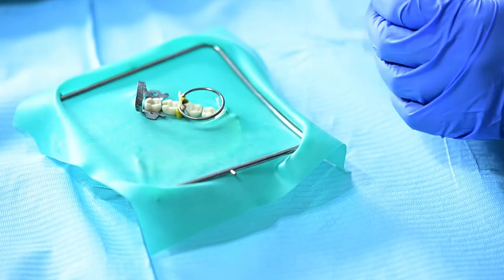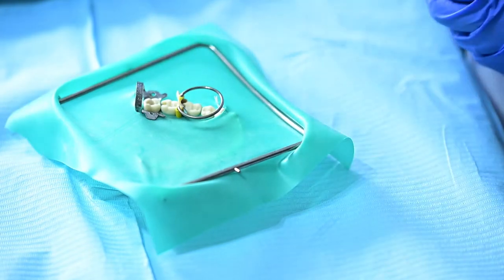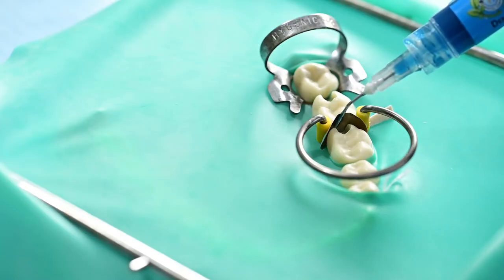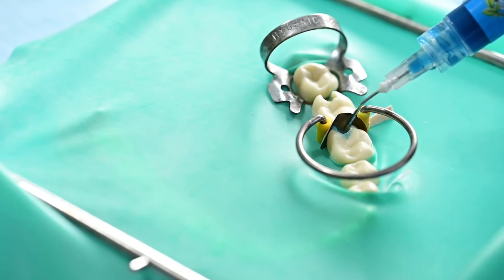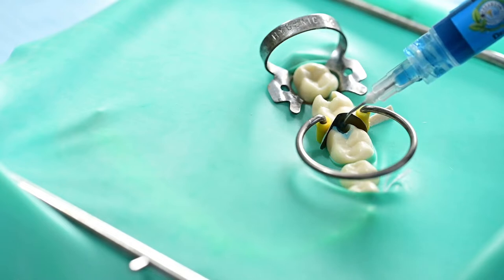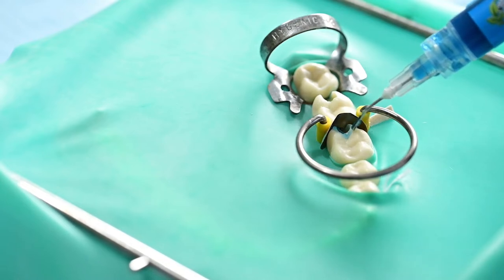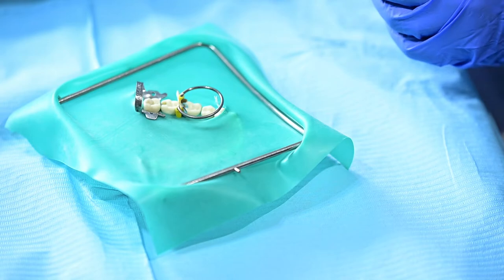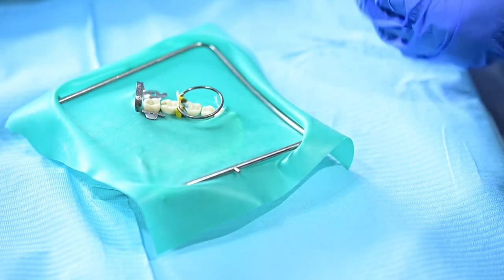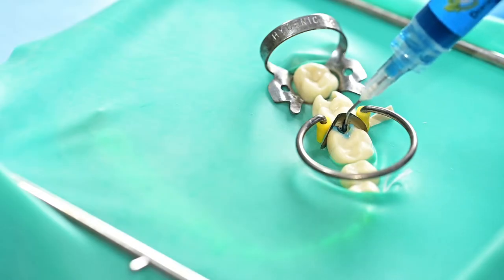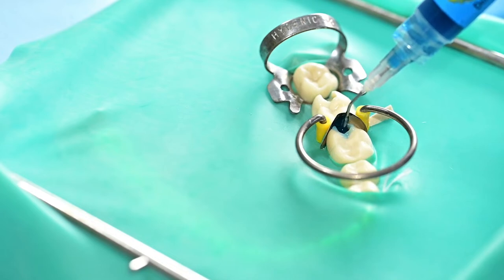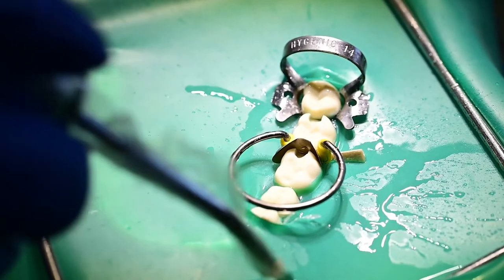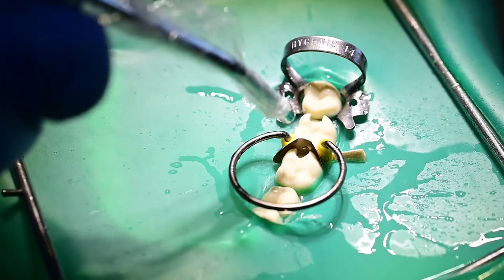After you have secured the sectional matrix I shall do total etching on this particular tooth where I first selectively etch the enamel. And then at the end of the 15 seconds I want to flood the cavity with the etchant. Because the bonding agent I have selected today is an etch and rinse or the fifth generation bonding agent. Because of the wet bonding that we want to assure has happened.